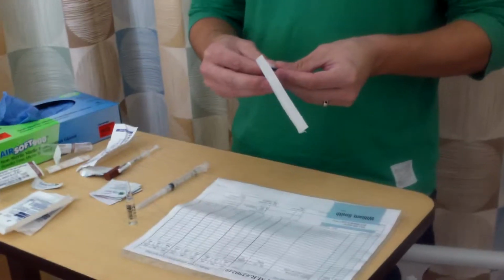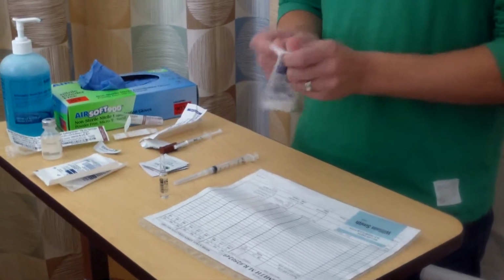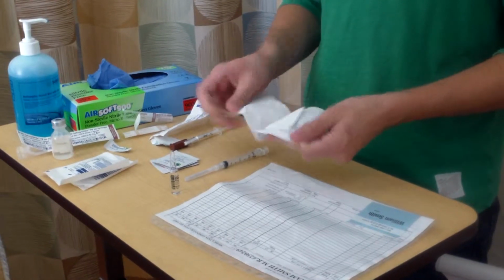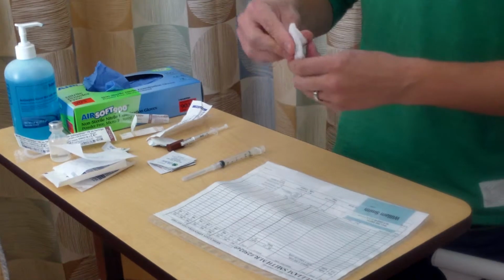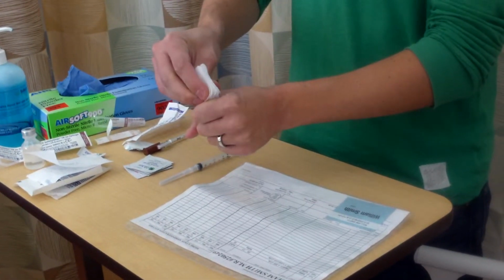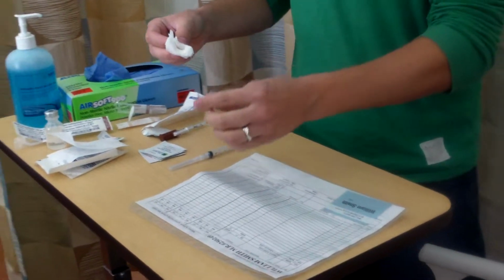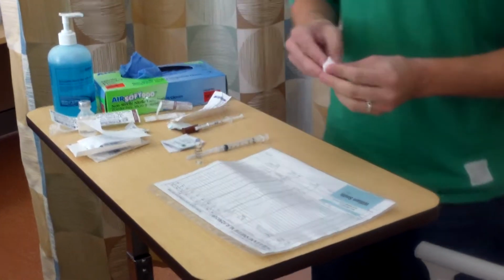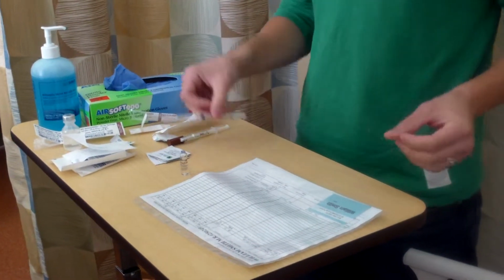Next, I need to open up my ampule very carefully. Take a piece of gauze. Take my gauze. And then very carefully, we're going to break this away from you. Alright, so just a little snap. There we go. And then I would immediately throw this in the sharps container. And once I have that out, I'm ready. Put that in the sharps container as well because there might be glass in there.